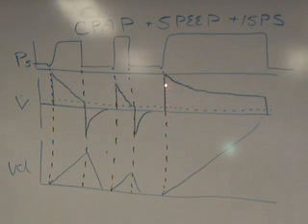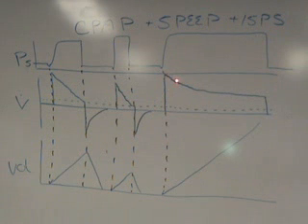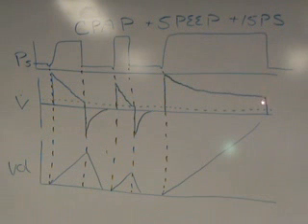In that case, pressure support has a backup limiting mechanism that says, hey, it shouldn't take this long to cycle me off, therefore I have a time limit that will turn this breath off after a certain period of time.